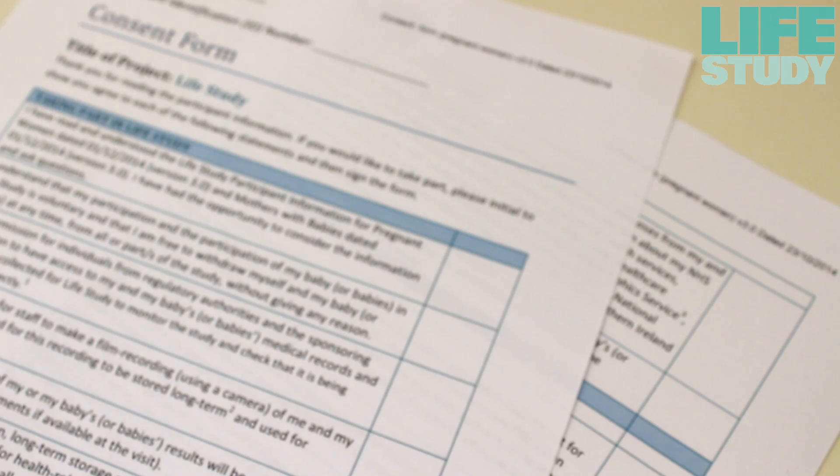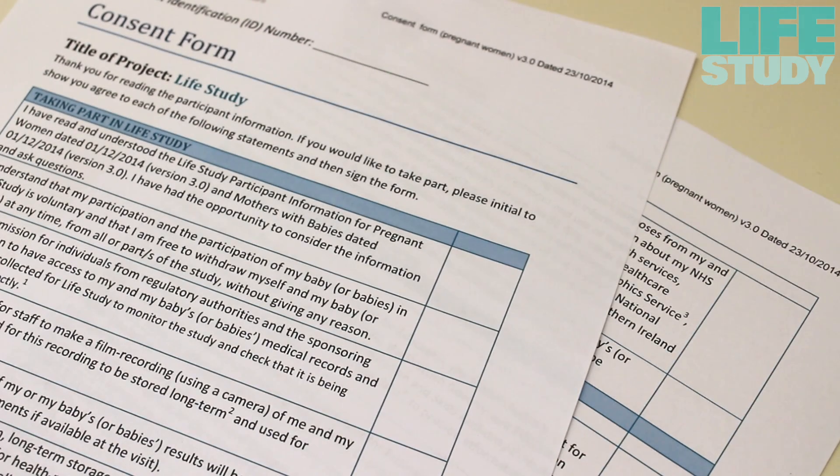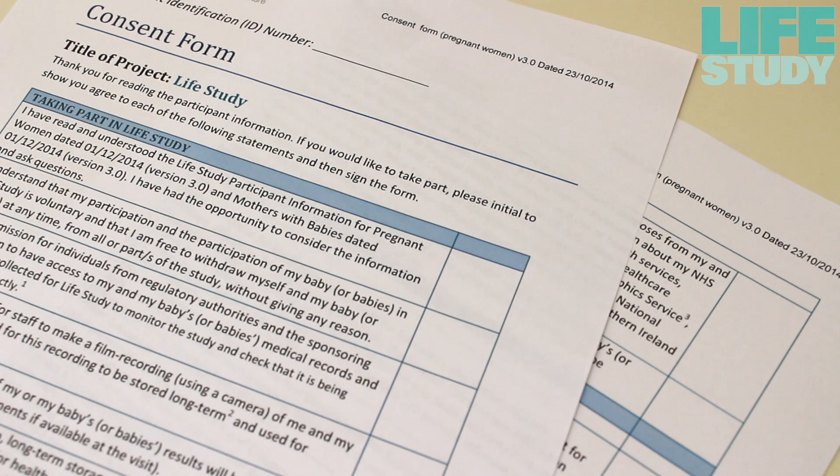Before you collect the sample, please check whether the woman has consented to give biosamples, and check that she is happy to give her baby's saliva.